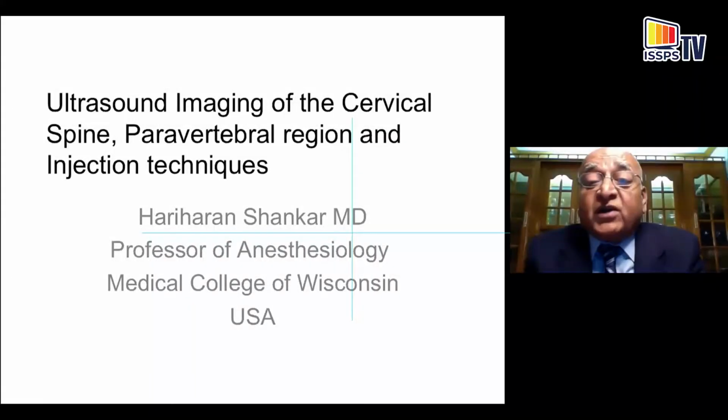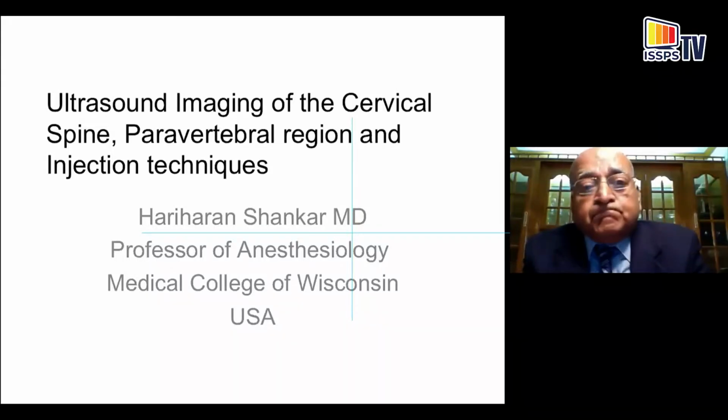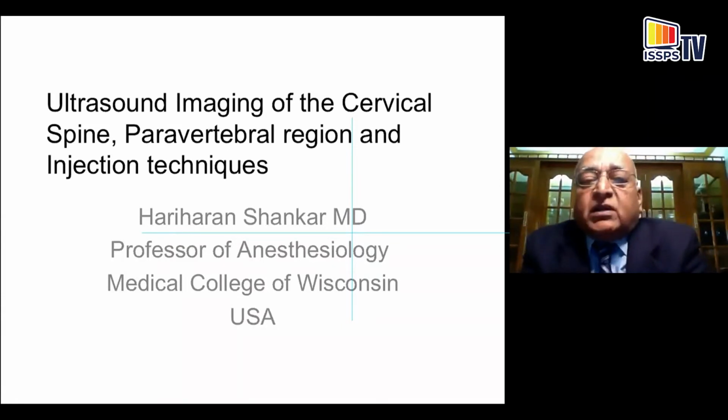I'm Shankar. I'm calling from Medical College of Wisconsin. I would like to talk about the ultrasound imaging of the cervical spine and paravertebral region and the various injection techniques.